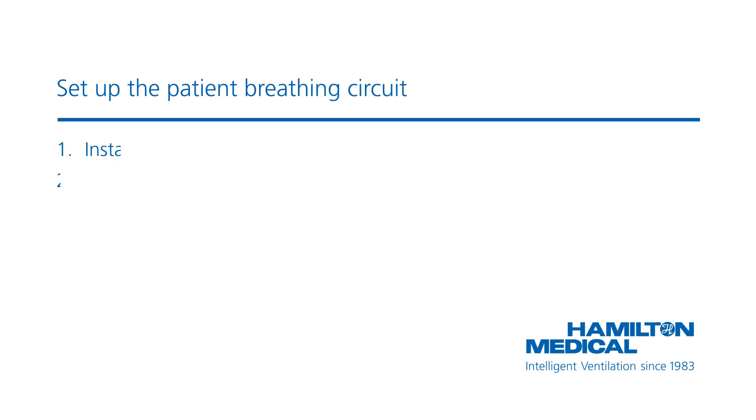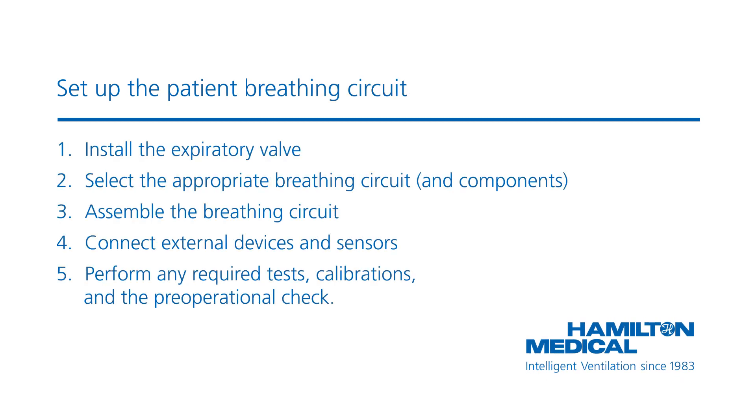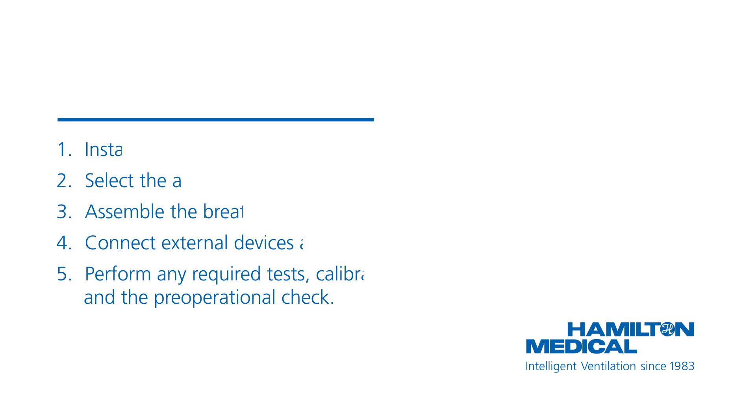To connect the breathing circuit, do the following. First, install the expiratory valve. Then select the appropriate breathing circuit and components. Third, assemble the breathing circuit. Then connect the external devices and sensors. Finally, perform the pre-operational checks.